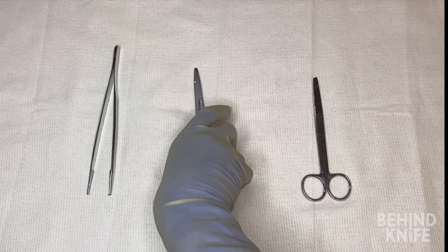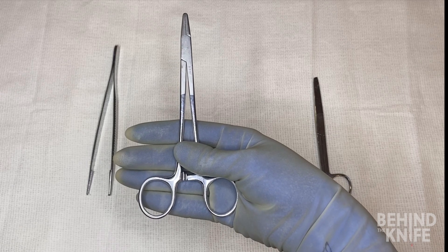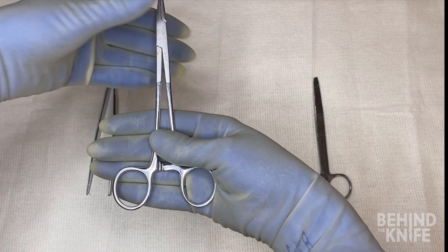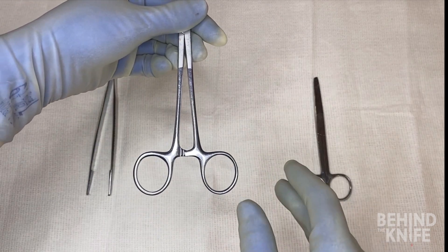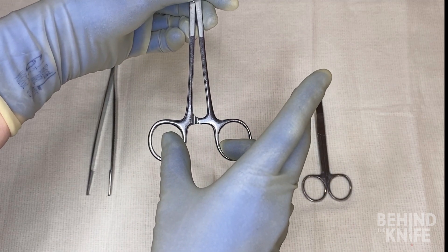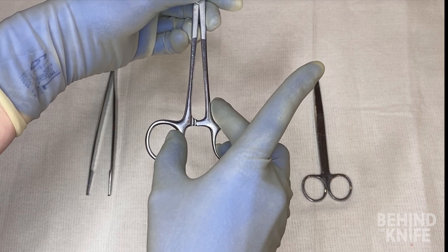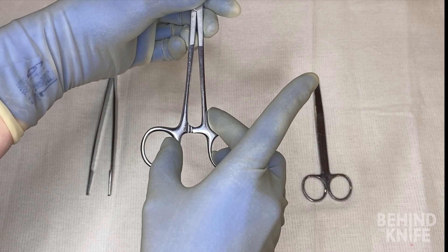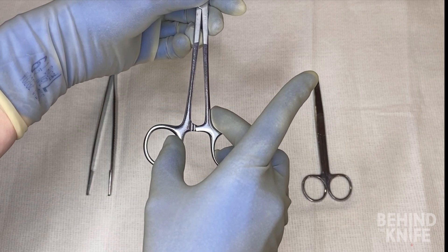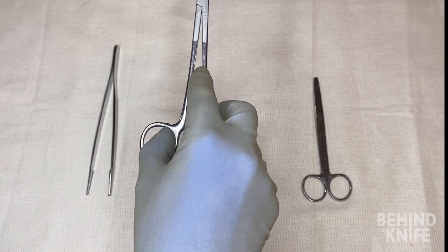Next, we'll move on to needle drivers. You may see your attending or residents hold this instrument in a variety of ways, but generally the best way when you're first starting is to place your ring finger and thumb into the finger holes, place your middle finger on the outside of the finger hole where your ring finger is, and place your index finger along the length of the instrument for stability.